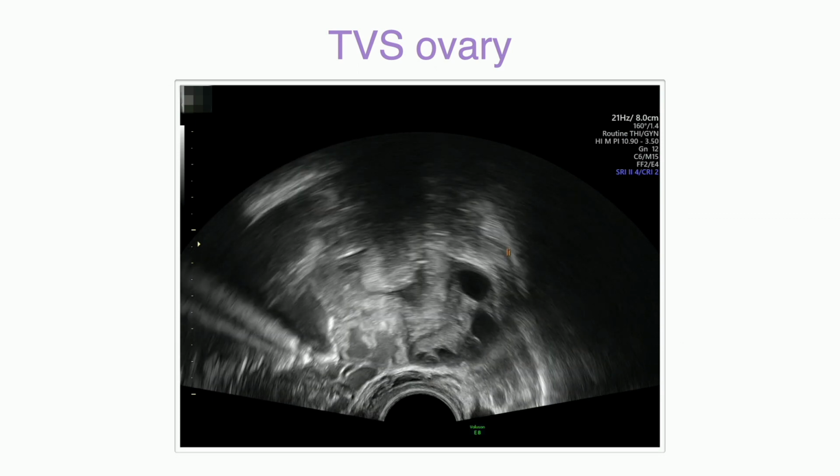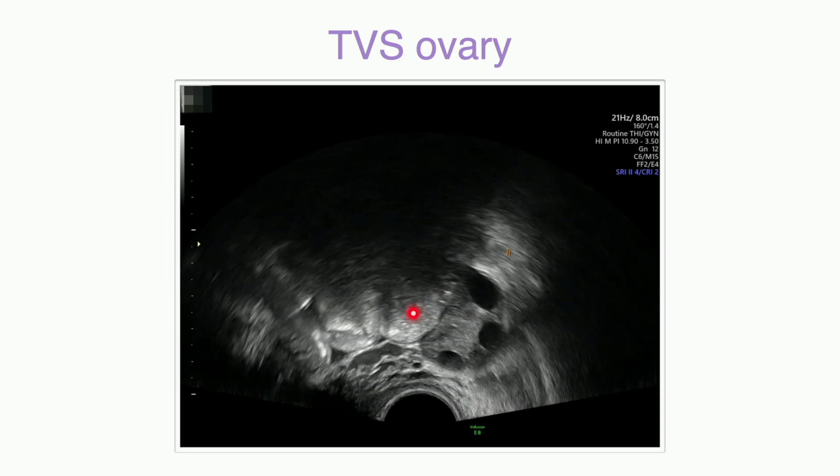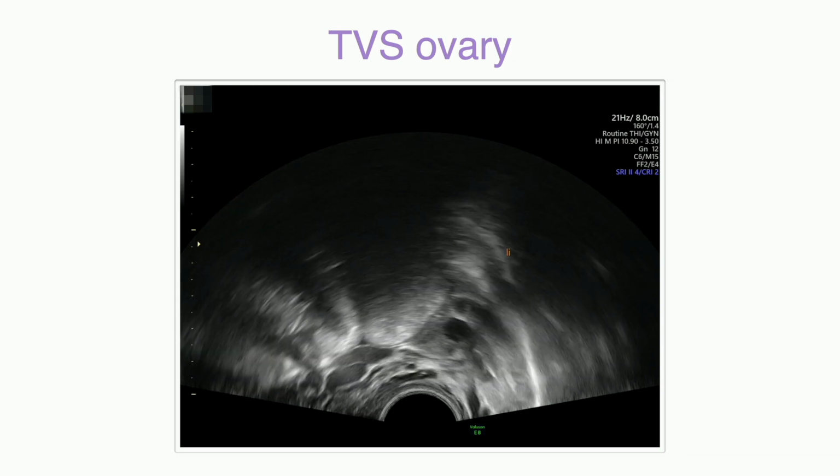In premenopausal women, the ovary clearly distinguishes itself from the surrounding small bowel. Of course, the appearance of the ovaries also changes throughout the cycle. But if you want to find out, you have to watch part 2.